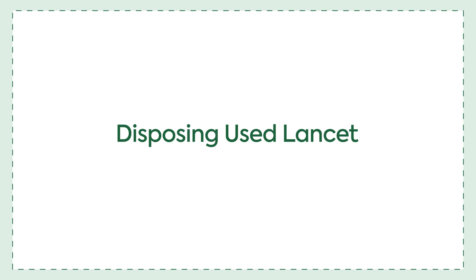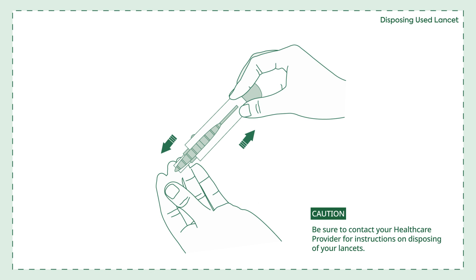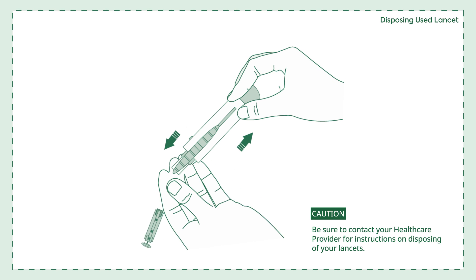Disposing of your lancet. Push the needle into the protective cover, then pull the lancet out. Be sure to contact your healthcare provider for instructions on disposing of your lancets.